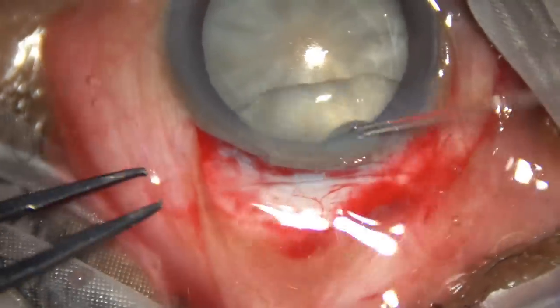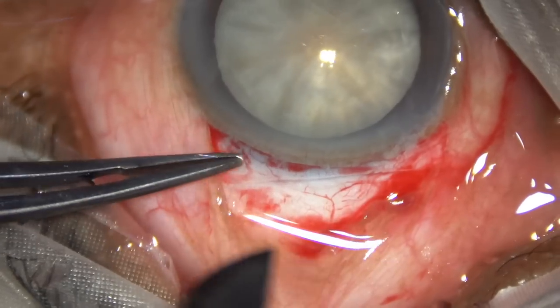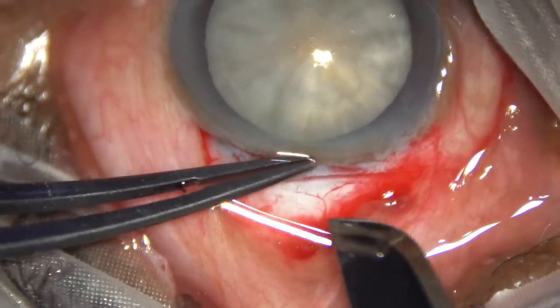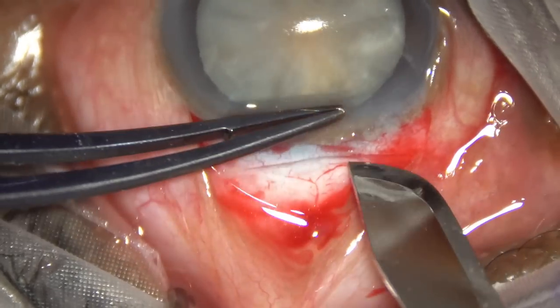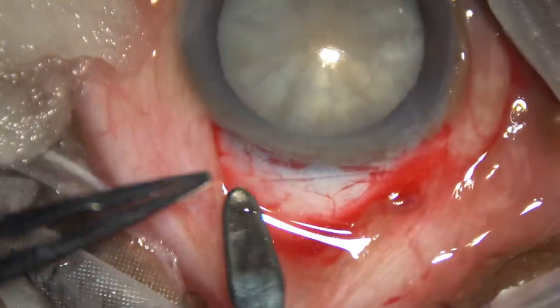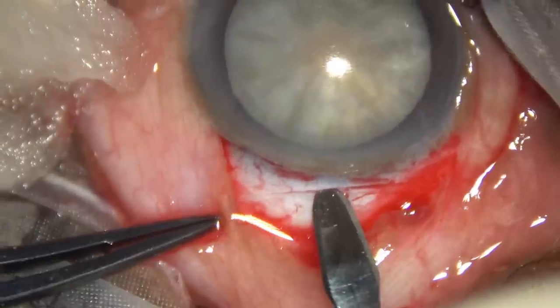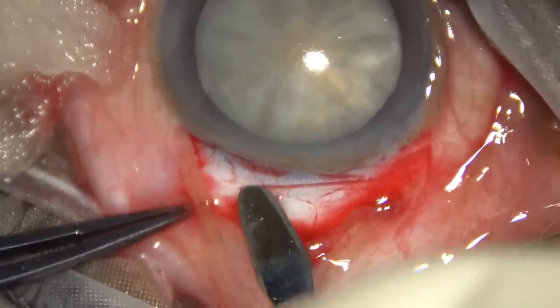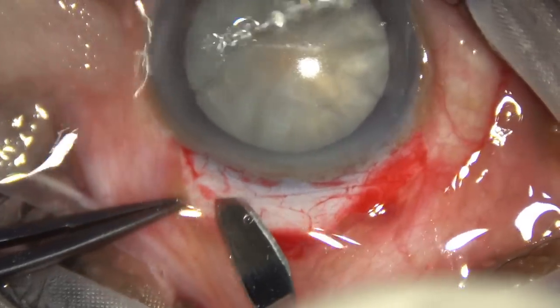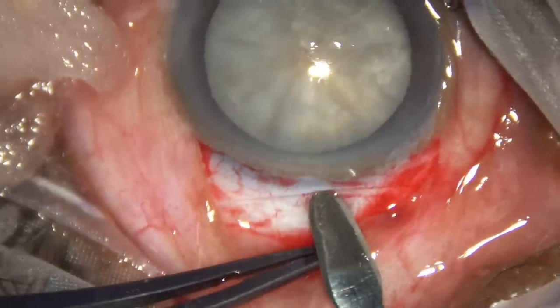So this is an incision with a 15 number blade. Now this bevel from here to here, this bevel is placed from one end to the other end so that we get the right plane for making the sclerocorneal tunnel.